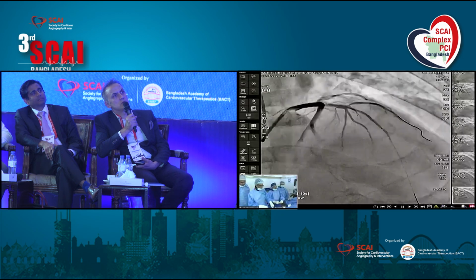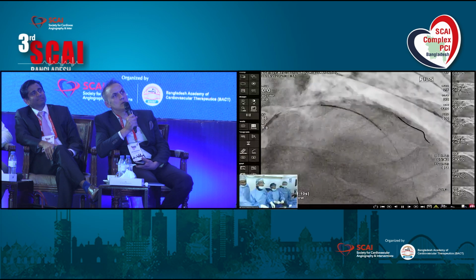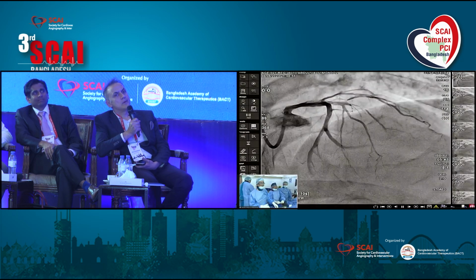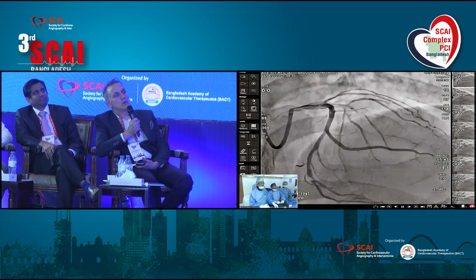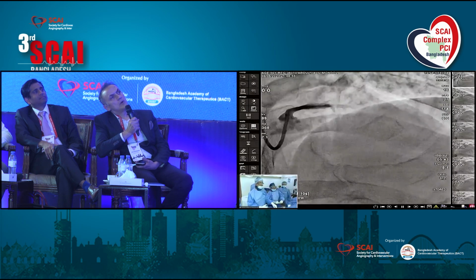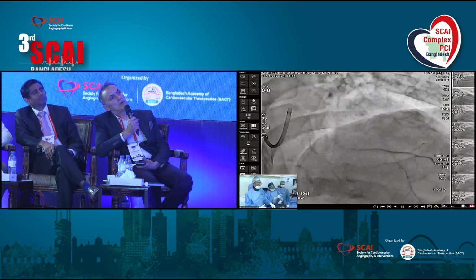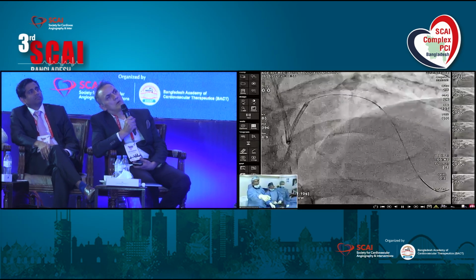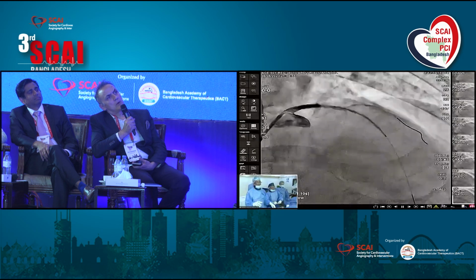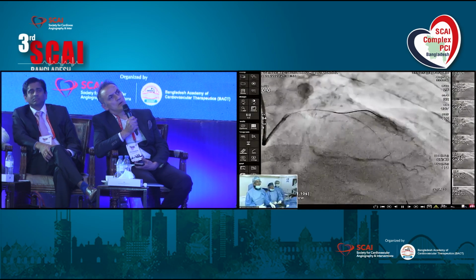We shall go to the low pressure. Distally, I think we are missing an area. So as it is 3, we should cover the distal first, then we can put, if needed, a 3.5 or 4 millimeter stent proximally. Agreed, but you see the previous view. Show them the previous view. Yes, now, at the level of the distal diagonal, that is quite normal, yeah? Just before. That is a good landing zone distally, yeah? Okay, then that's it.